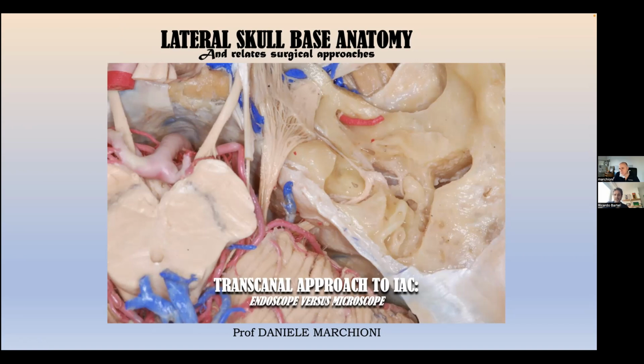So I understand from the presentation that you have moved, for treating intracanalicular acoustic neuromas, from the translab approach to the transpromontorial approach in every case, or do you still decide depending on the conformation of the internal auditory canal? It's really important, in my opinion, to check the CT scan. Sometimes when I have a small internal auditory canal, really narrow and really long, I prefer to perform the translabyrinthine approach, because the surgical field with the transpromontorial approach is really deep. You understand? But just in some cases.